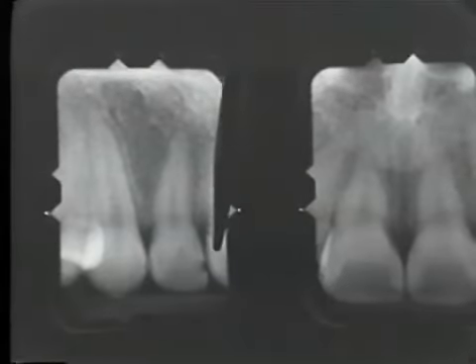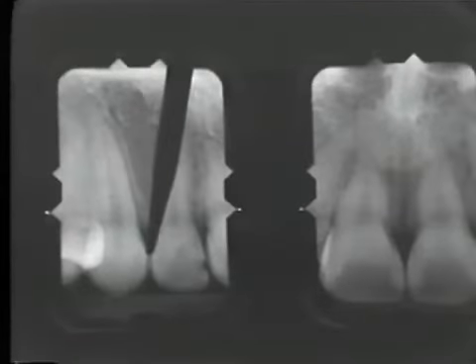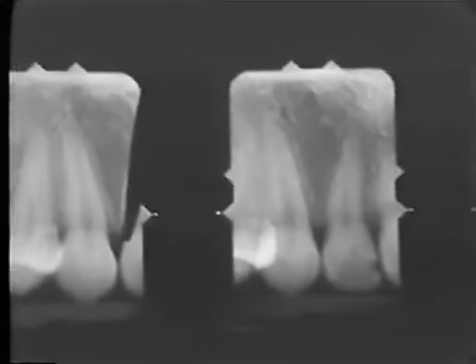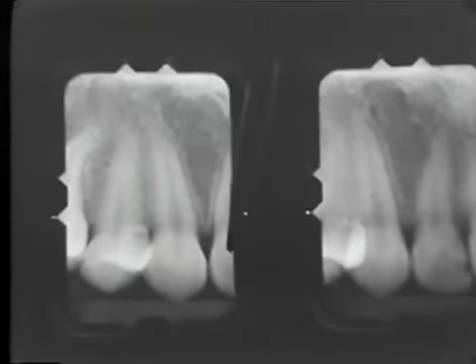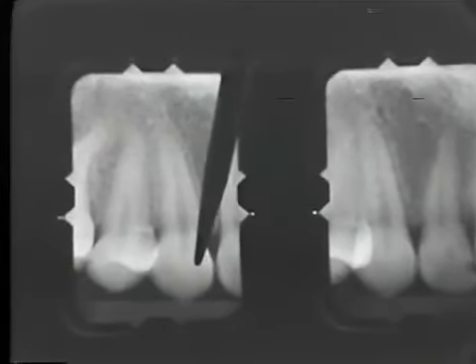Many times the distal surface of the lateral will be overlapped onto the cuspid. When we radiograph the cuspid, again, we try to open the mesial contact, thus showing the distal of the lateral and the mesial surface of the cuspid.